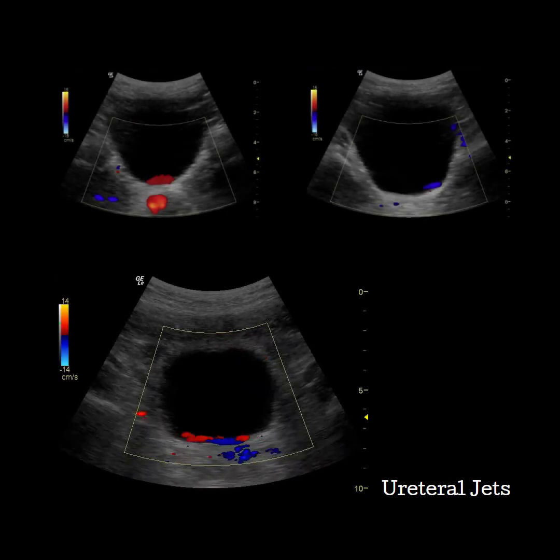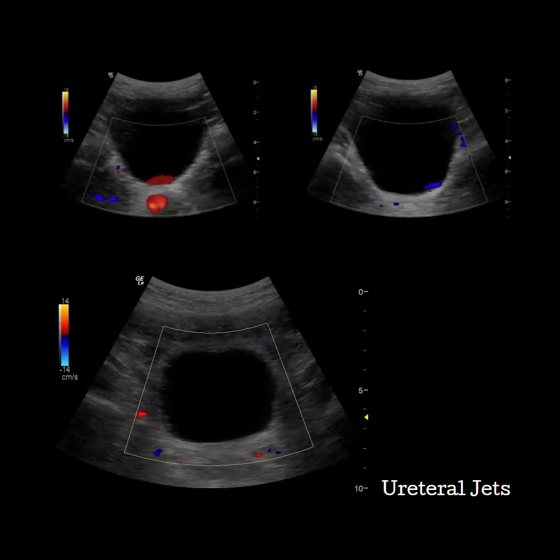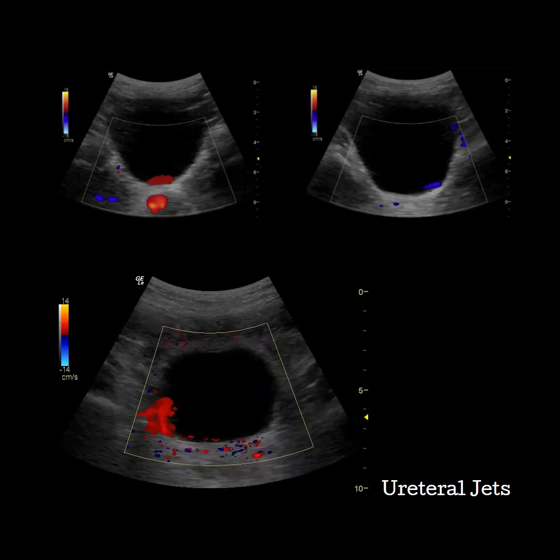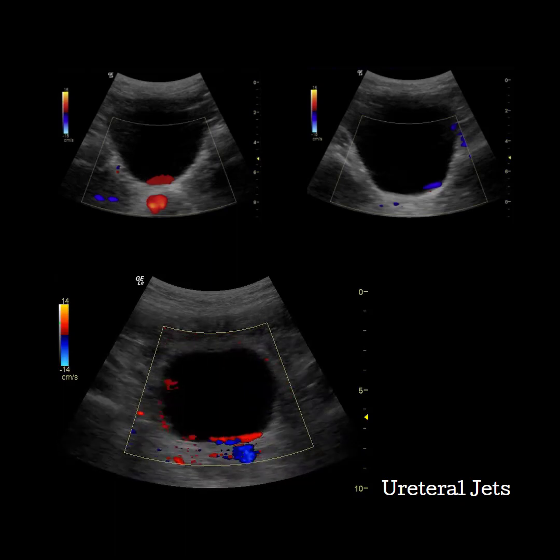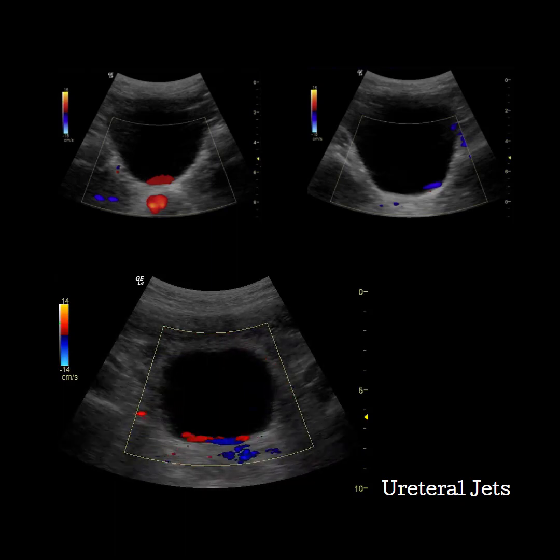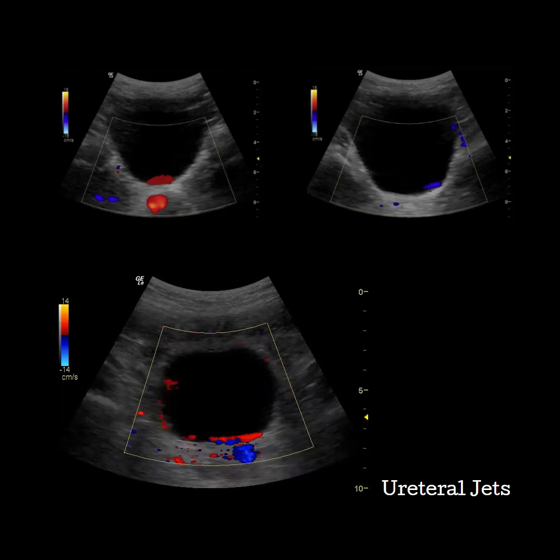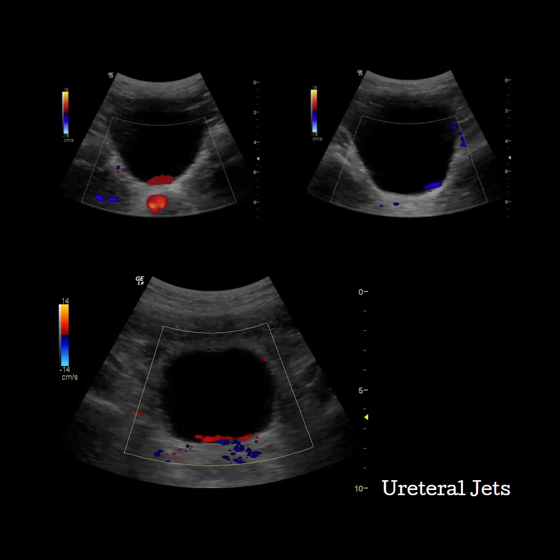Angle the transducer towards the trigone, or the inferior portion of the bladder — this is where the ureters connect to the bladder. Open your color box to cover the whole bladder and a little beyond. You should be able to see color in the iliac vessels on either side of the bladder. Holding this position, wait to see urine enter into the cavity. Both ureteral jets should typically be seen within a five-minute window.